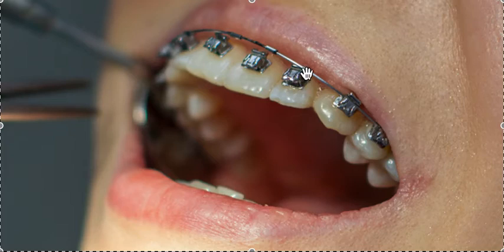The difference is that the wire sits in the bracket which has a trap door snapped down over it. A regular rubber tie — or o-ring — holds the wire in the bracket but has to be changed regularly because it degrades over time, lasting only about six to eight weeks. Whereas with the trap door, if you put a nice heavy wire in and snap that door down, you're good for a few months — fewer appointments and more efficiency, assuming your doctor places the brackets correctly.